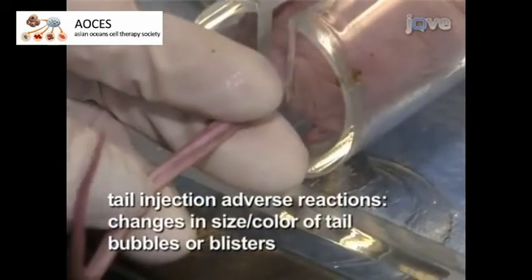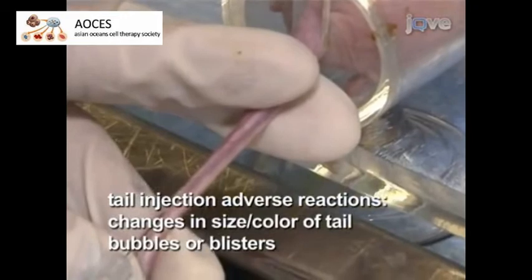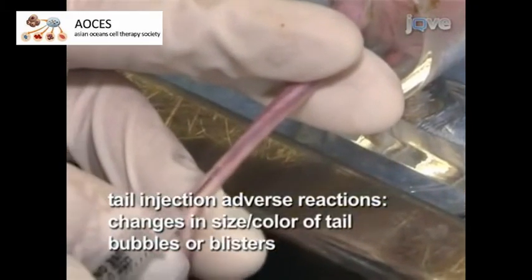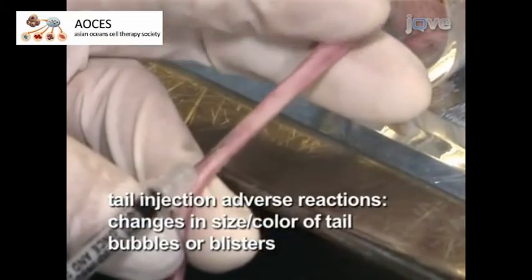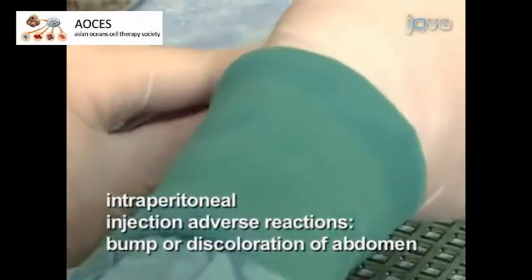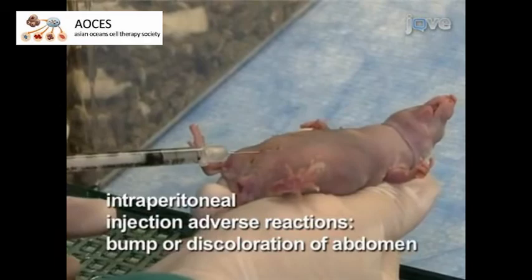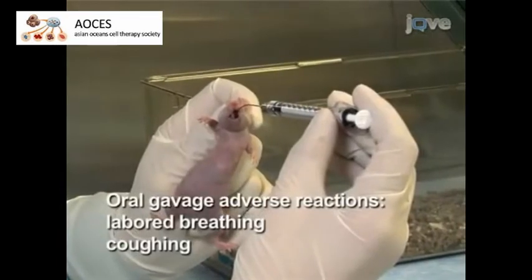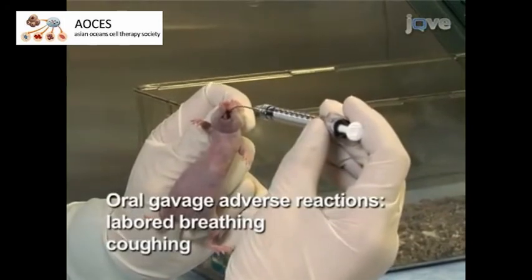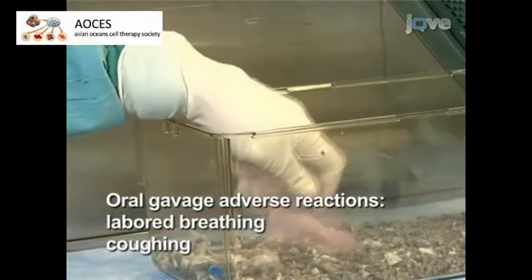The following are indicators of improper injections. For tail injections, change in the appearance of size or color of the tail, a bubble or blister in the tail indicating subcutaneous rather than intravenous delivery. For intraperitoneal injections, a bump on the skin or discoloration of the abdomen may indicate subcutaneous injection or damage to internal structures. In oral gavage, a mouse with laboured breathing or coughing may indicate that fluid was injected into the lungs rather than into the stomach.